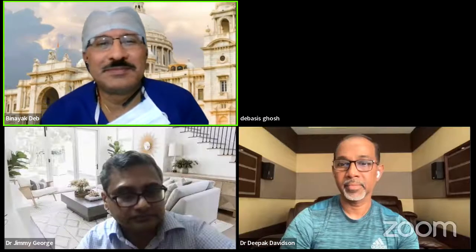So, Dr. Ghosh, any comments from you? No, I think it's all right. You learn more from cases which have not gone right. I think that is the bottom line. I think that was great, and I would agree that you can rarely cover the ostium perfectly. You have to come back to the left main.